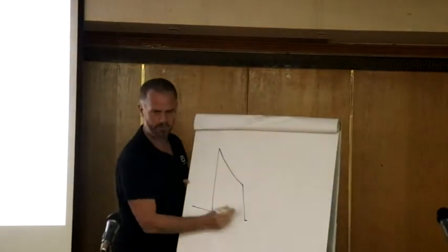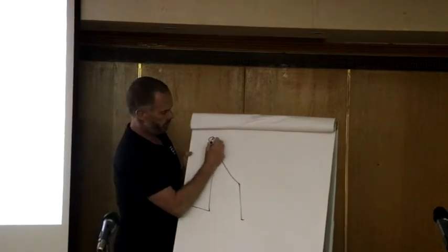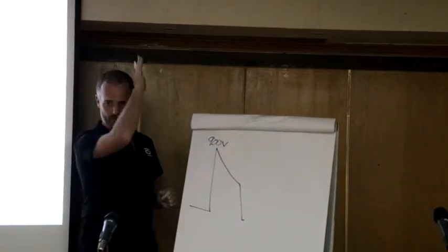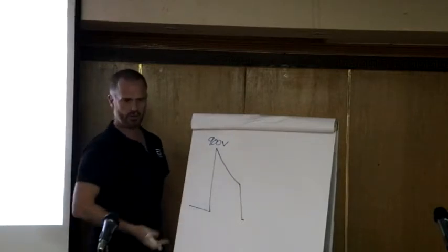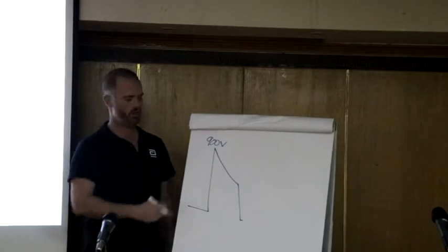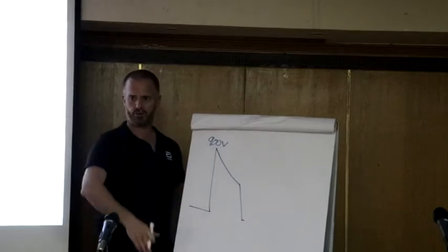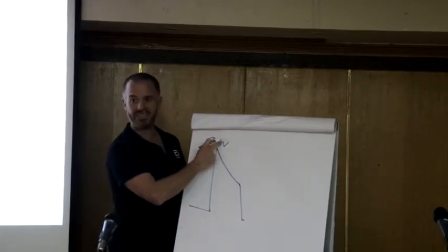Here's just a monophasic waveform. Let's say this is 900 volts. This is the capacitors discharging. This is the voltage on the capacitors bleeding across the patient when he's shocking it. The capacitors charge up, and then this is it as it empties current across the patient. So we start at 900 volts, and then the voltage is dropping because the capacitors are pushing current across the patient, and then at a percentage of this number, that's the tilt, okay?